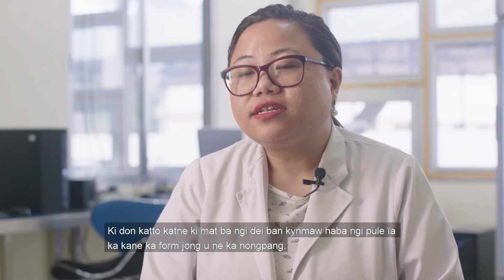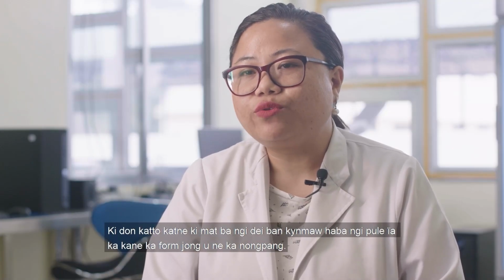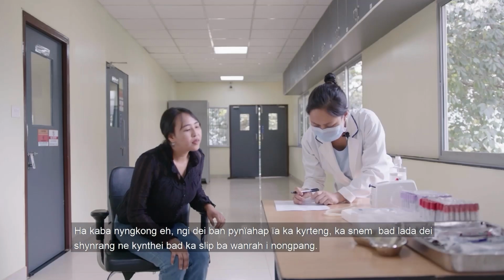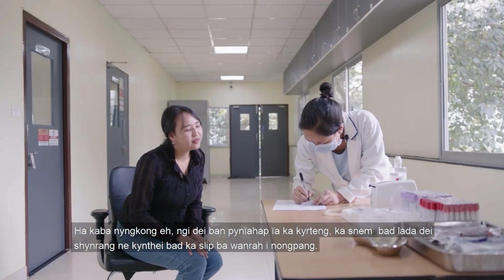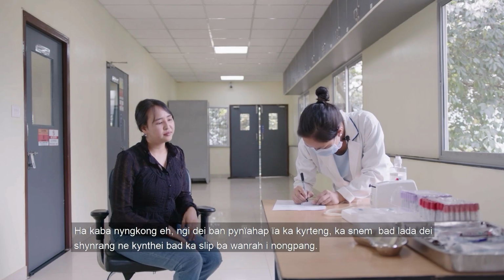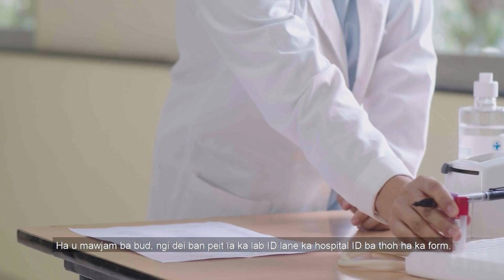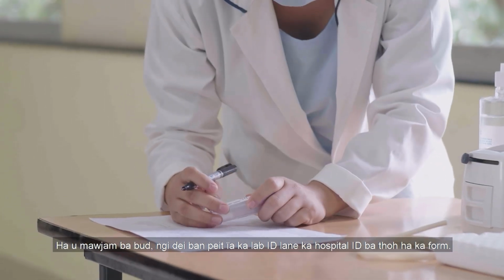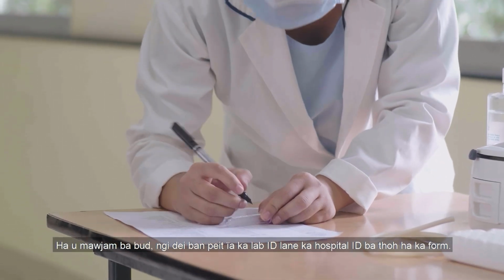Certain points need to be kept in mind when we go through a patient's test requisition form. First of all, we have to confirm the name, age and gender of the patient with the requisition form that comes along with the patient. The next step, we look at the lab ID or the hospital ID that will be mentioned in the test requisition form.